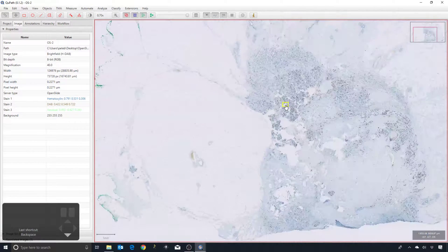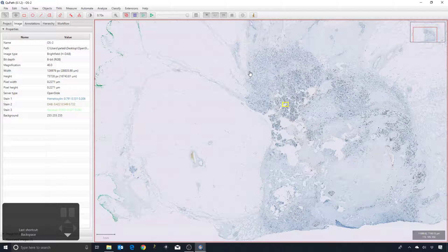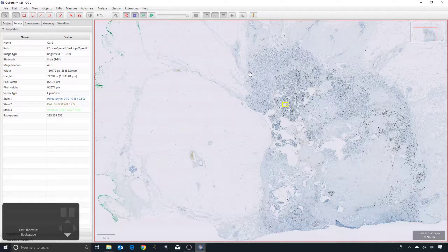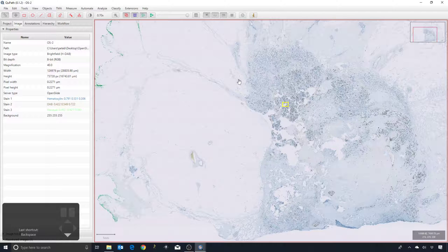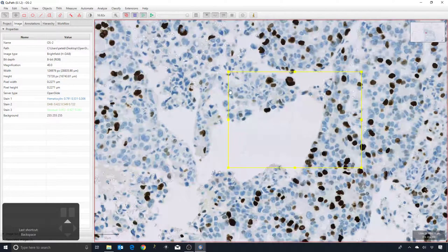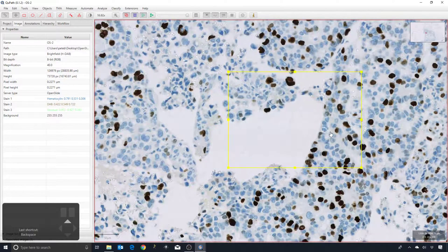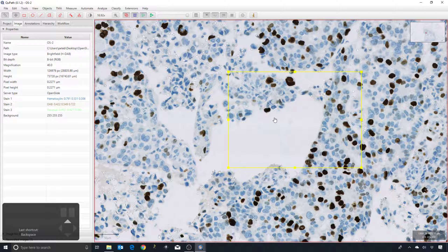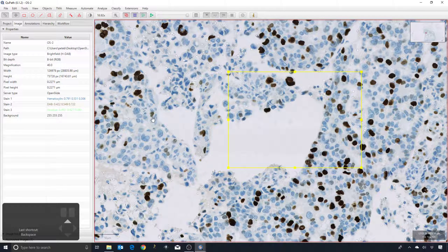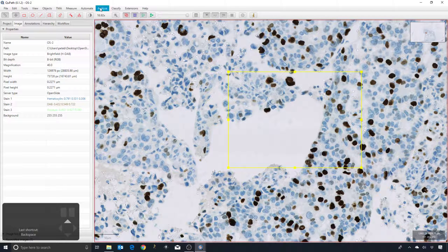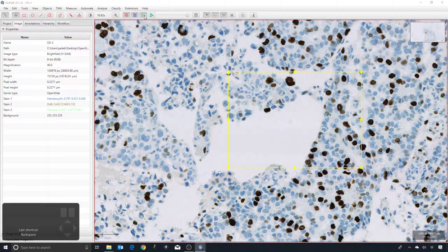I want to make this as small as possible while still giving a good range of examples. If I choose a very large region, then QuPath is going to have to scale it down and that's going to end up smoothing pixels and smearing the stains into one another. When it does a calculation, it's not going to be as good. So I want to use a fairly small region that QuPath can handle all in one go, but I want to have blue, brown, and background within it. Then I go to Analyze, Pre-processing, Estimate Stain Vectors.